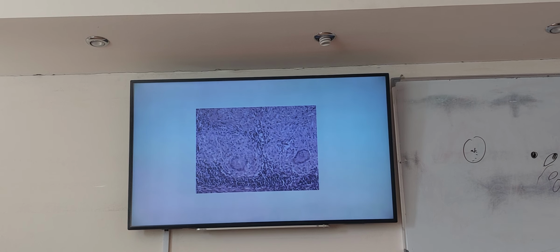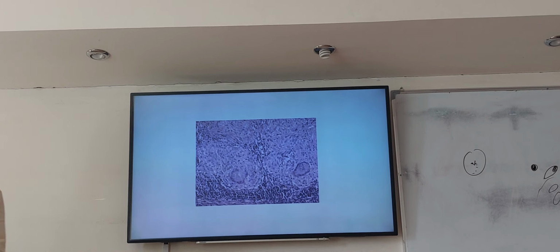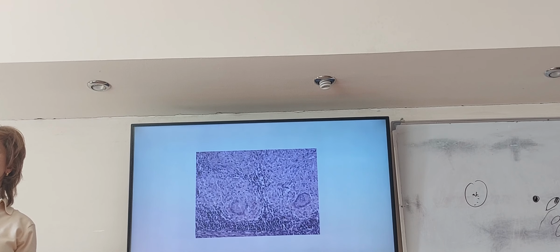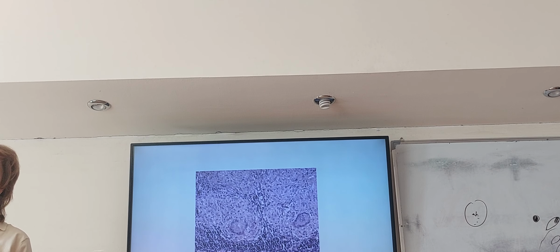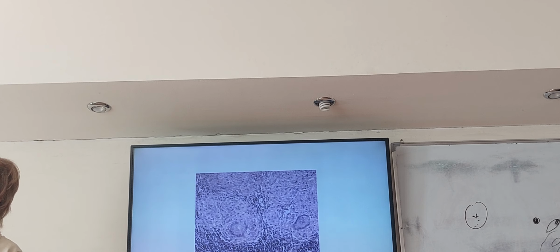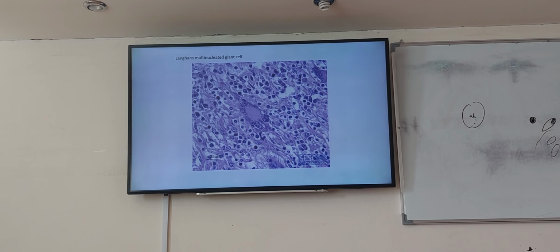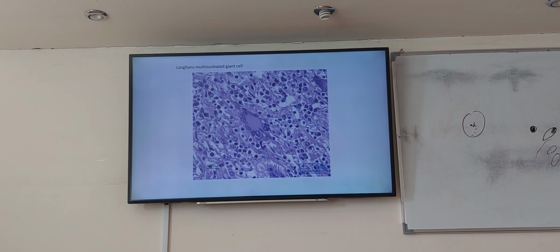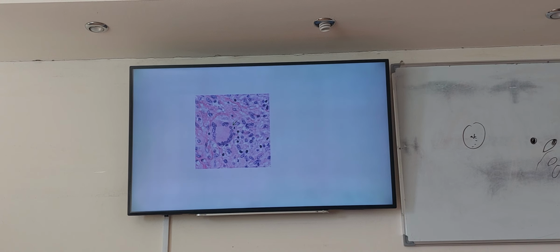What is important for me this year is that these pale aggregates, you tell me these are granulomas. These are epithelioid cells. These are multinucleated cells. And there is no necrosis in the central part. All my questions will be concentrated on this, because this is what I want from you now. Which cells? Langhans. Multinucleated giant cells of Langhans type. Same Langhans. Okay?